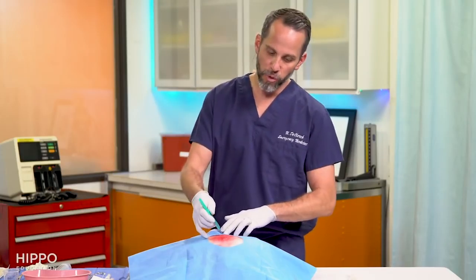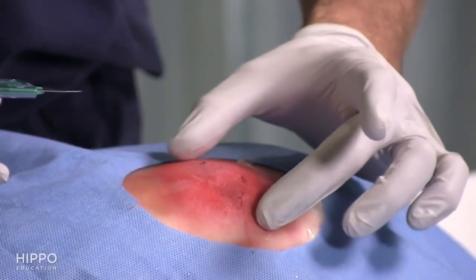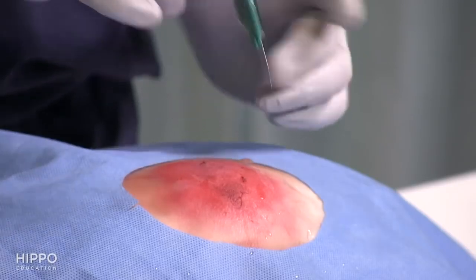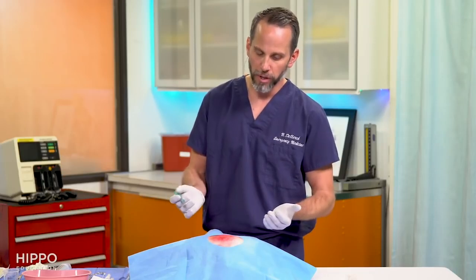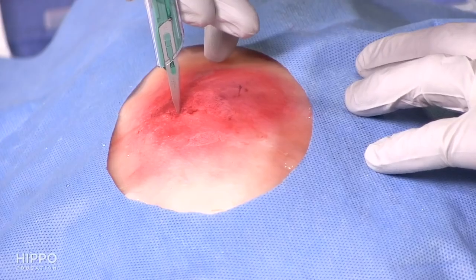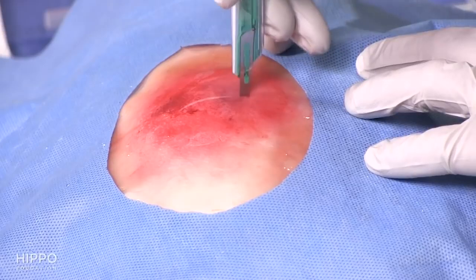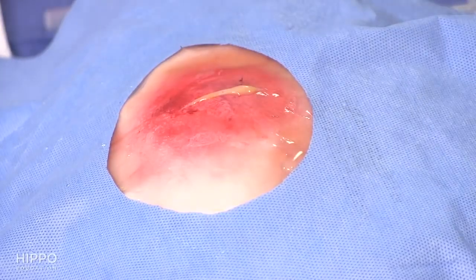The other thing to remember is to make the incision along the entire length of the abscess. Feel for the fluctuance — I can feel my abscess pocket runs between here — and really take advantage of that to open it up fully. Never make a small hole and try to work through it; that makes access very difficult. Opening it appropriately is important. You obviously don't want to make a huge laceration if you don't have to, but don't be too gentle. Take the blade, cut over the anesthetized area, and you know you're in the abscess when purulent material and fluid start coming out.